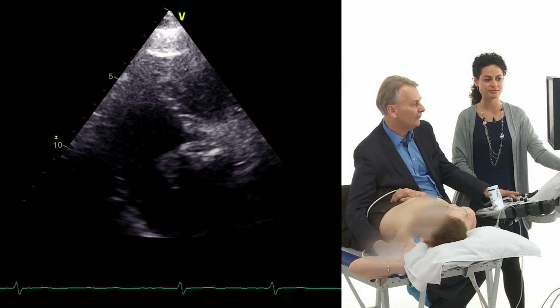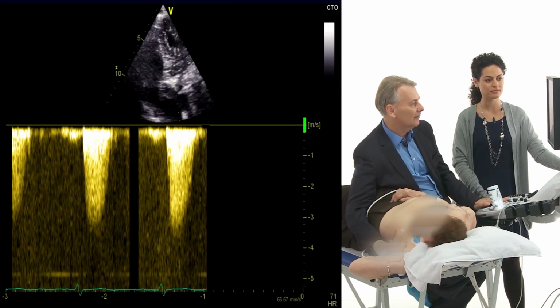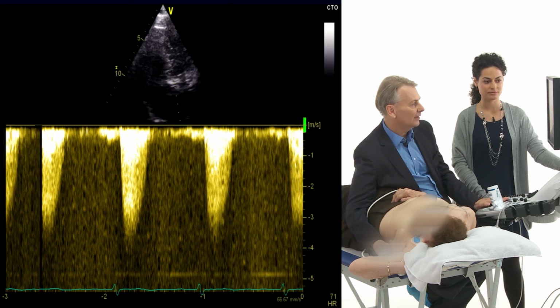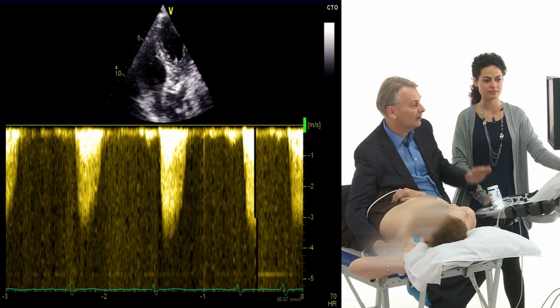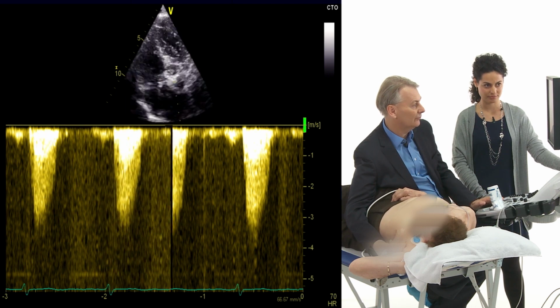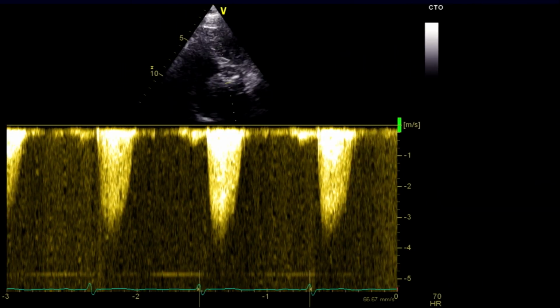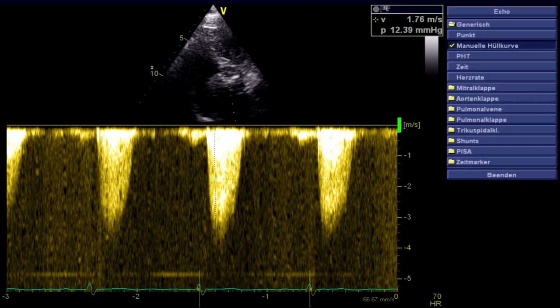And we do that in a 5-chamber view, ideally, so that we are better oriented to the flow of blood through the stenotic valve, so that the septum is usually slanted a little bit the way you have it in our view right here. And then you put the continuous wave Doppler through, and then you would simply trace the curve.